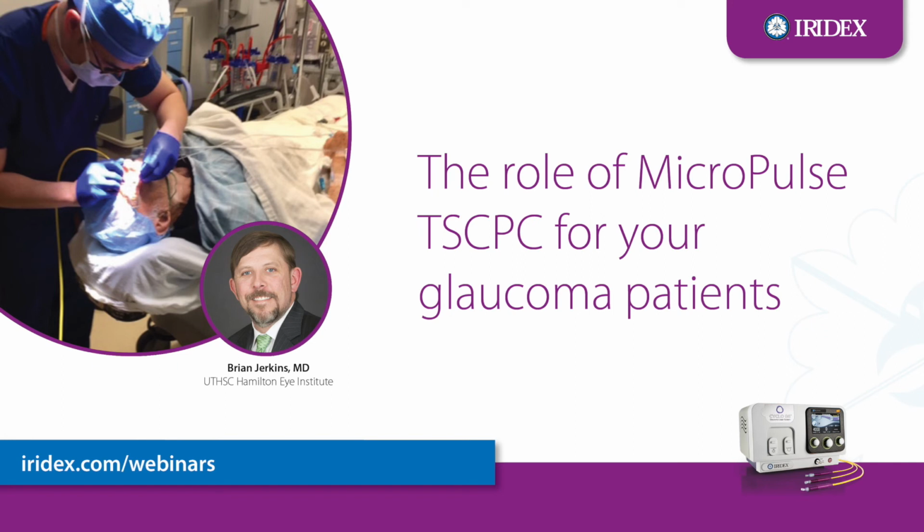I would say the standard way I do it is in our ASC, usually quickly between some other patients while they're setting up another room. I try to flip 2 rooms when I can. They give generally a mild dose of propofol if the patient's very healthy, and I'm literally sitting there talking to the patient while they're getting a small dose. As soon as the anesthesia hits them, I generally do, preoperatively before the MicroPulse, a small retrobulbar block, more for a little bit of proptosis for me, as well as a little bit of potential post-operative pain. And then I do my MicroPulse procedure very quickly while we're all there. Then I put a patch on the eye for a couple hours, and that's it.